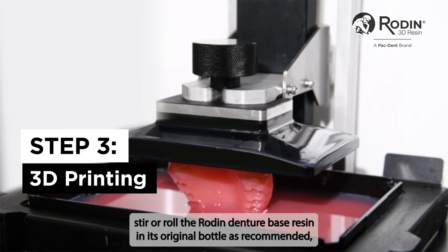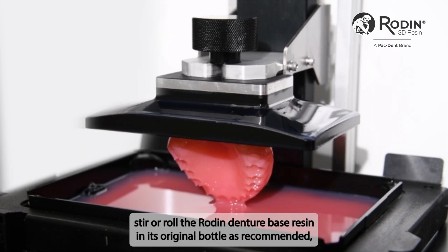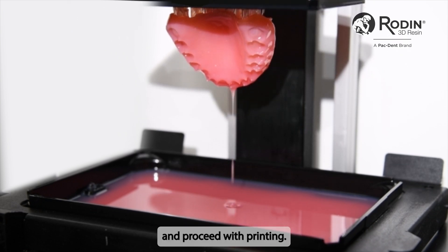Before printing, stir or roll the Rodin Denture Base Resin in its original bottle as recommended, and proceed with printing.